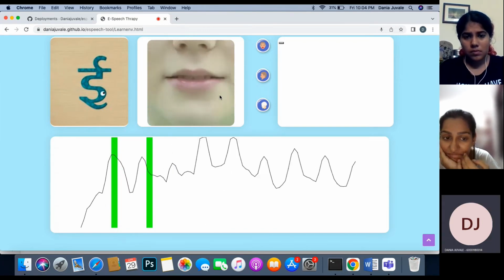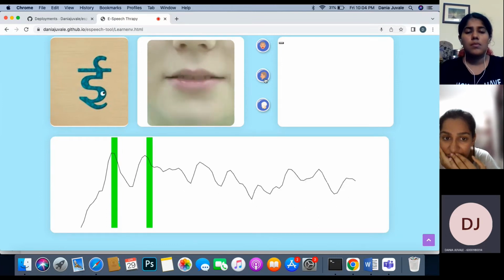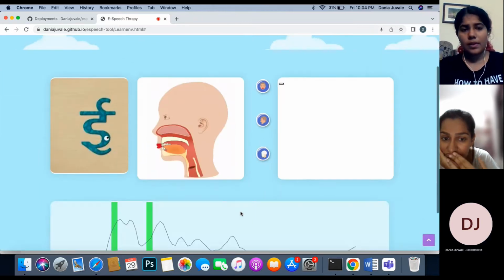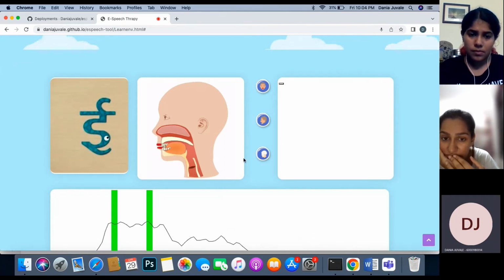Here we have the animation for the letter E. This is the front lip movement. This is the side lip movement. And this essentially shows the lip as well as the tongue movement, which the child can refer to.